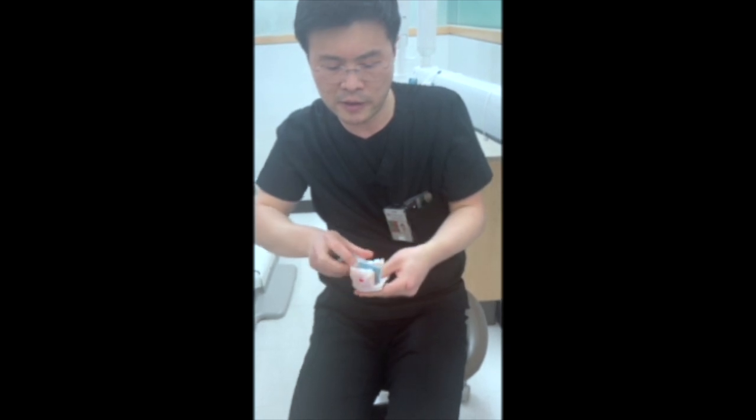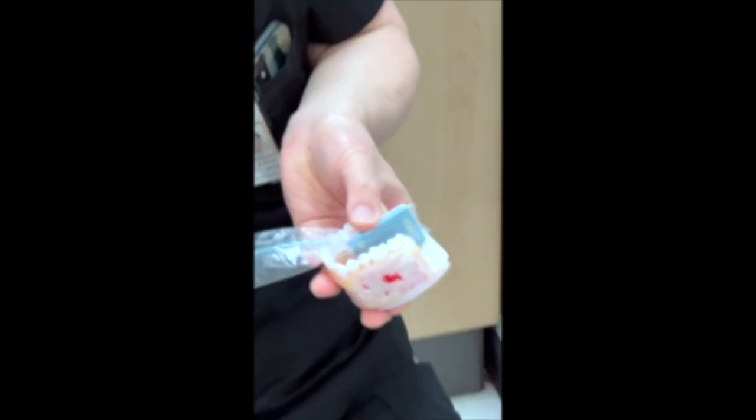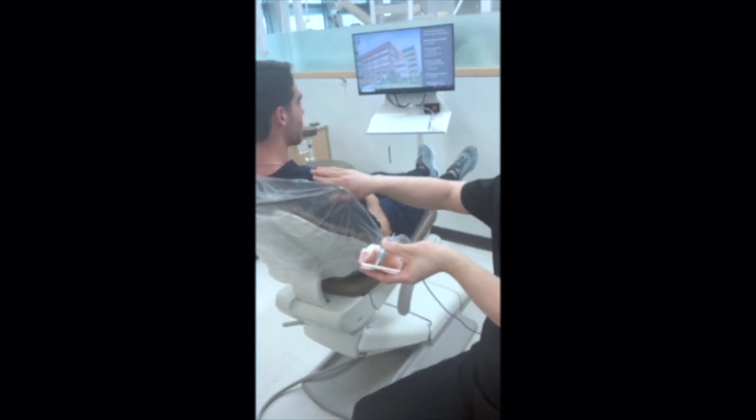So what you can do is very gently push down. And Dr. Zhang's personal tip that he has to offer us, using your thumb to push it down, is he'll stand behind the patient and gently just tap them on the shoulder. Just please relax, in a very gentle, calming voice.